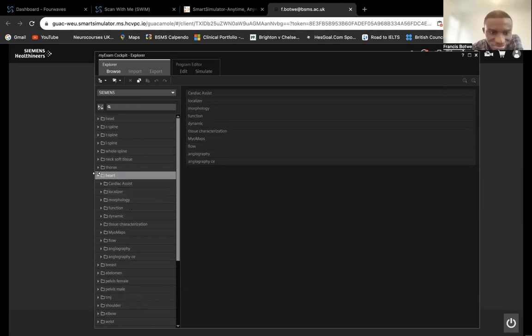But that's kind of what we're looking for, that you are thinking about the process and you're thinking, wait a minute, I need to scan this patient, but I don't have contrast. So think about it in a sense where you don't have contrast in your clinic. We've had gadolinium shortages before. So think about it as one of the cases where it's not possible for you to do GAD, but you know that GAD is indicated, and you just have to explain to us that GAD is indicated. This is how you'd have done it, stuff like that. That's what Francis is thinking.